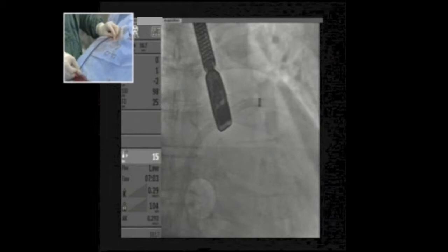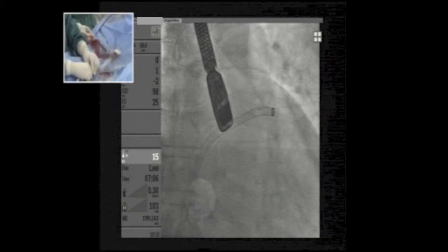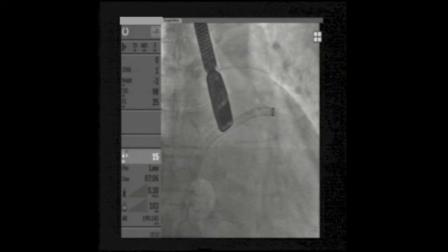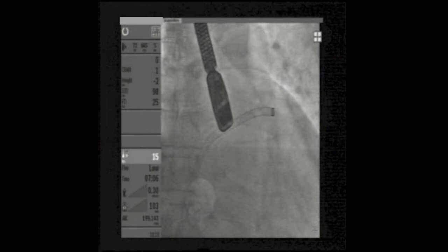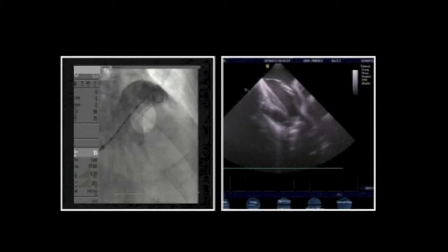We are going to deliver the device in the RAO cranial view. We should have both fluoroscopy and echo simultaneously for deployment. We are quite far into the appendage, so we should start deploying here. I want to stay stable in the appendage, pull back on the sheath to create a ball with the device, and then close and secure the lobe.